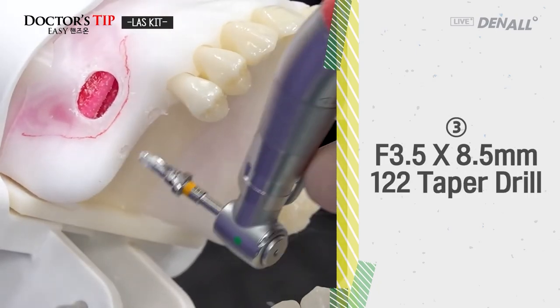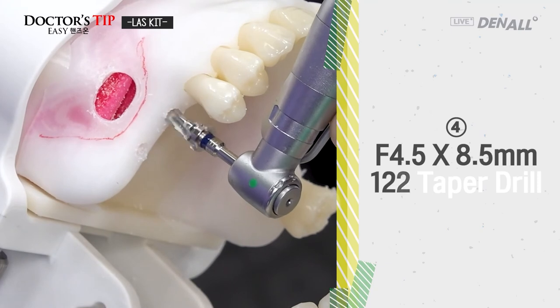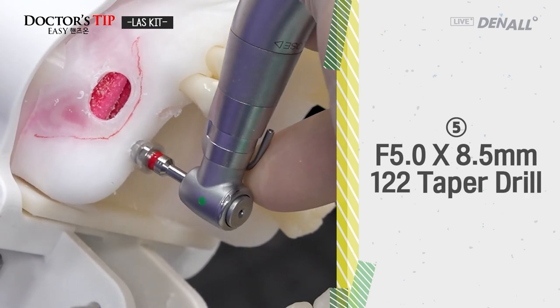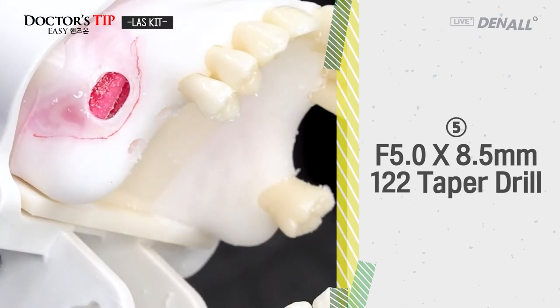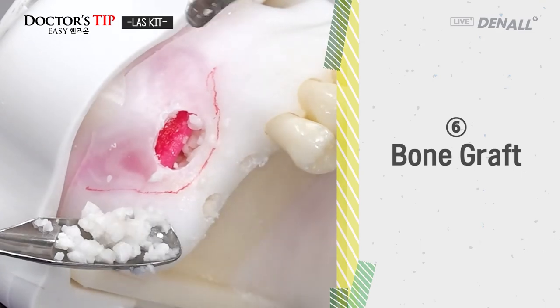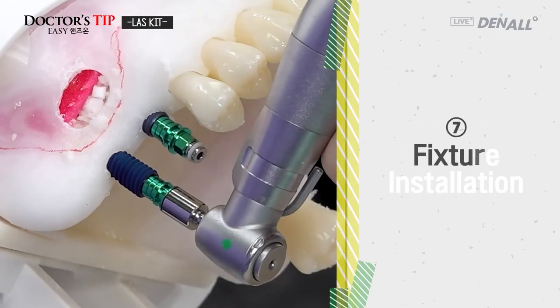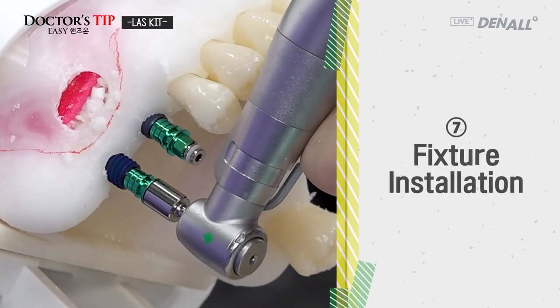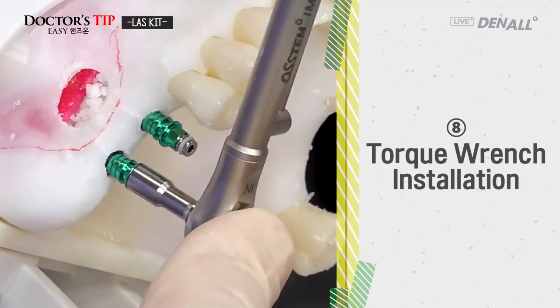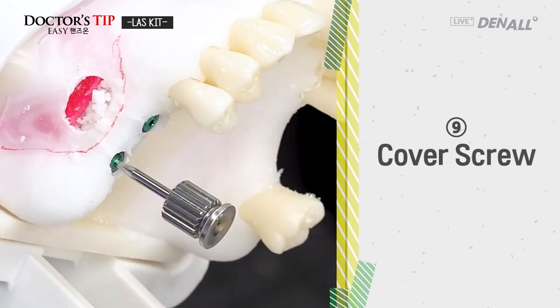So you drill up to the area you marked with a laser. Always when you perform sinus graft, make sure it doesn't go too much toward the back. Then you put in the fixture. Then you put it in place with the wrench. Like this.